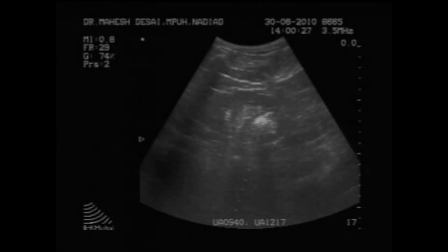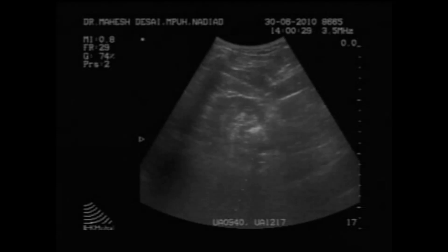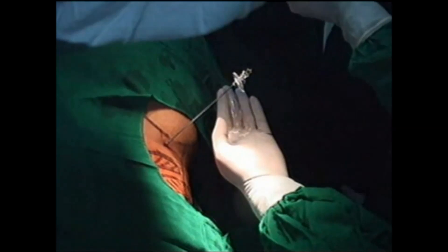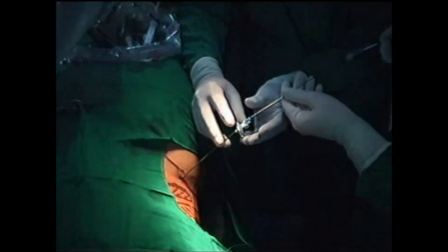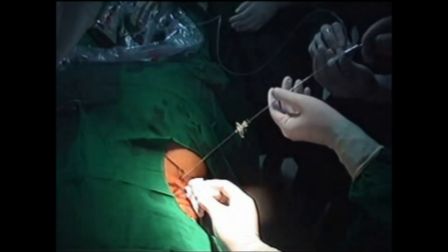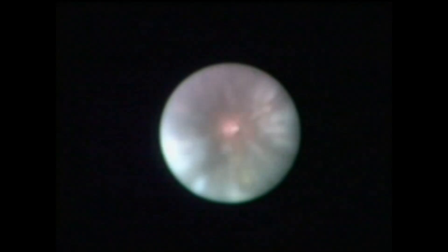Ultrasound-guided caliceal puncture is performed using a 16-gauge microperc needle. The puncture is confirmed using a contrast study and return of clear irrigation from a 5-French ureteric catheter. The 0.9 mm flexible microperc telescope is introduced through the stilette via a three-way connector.